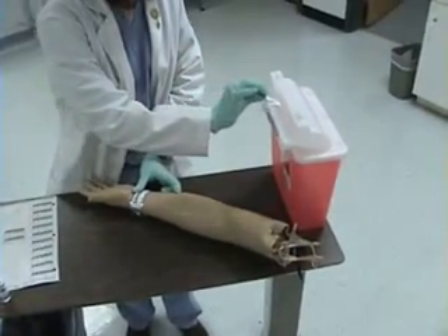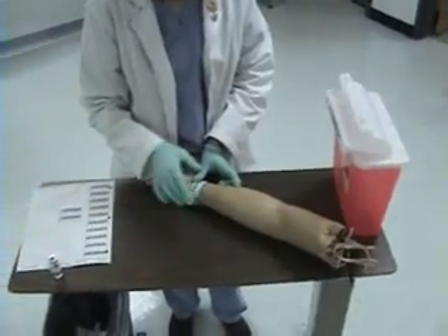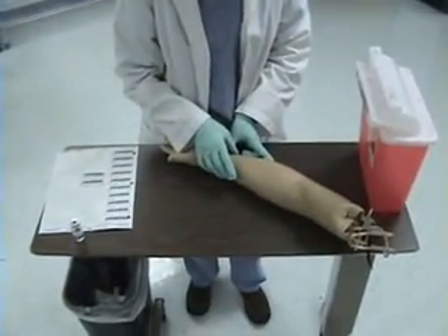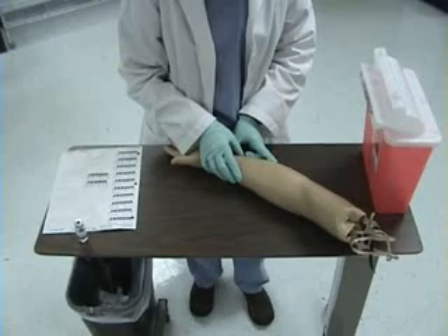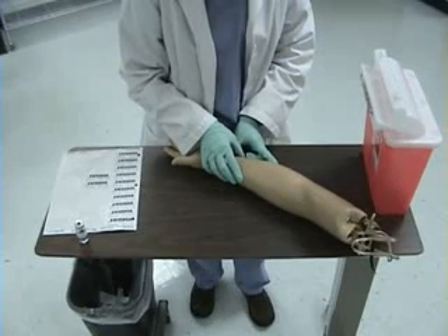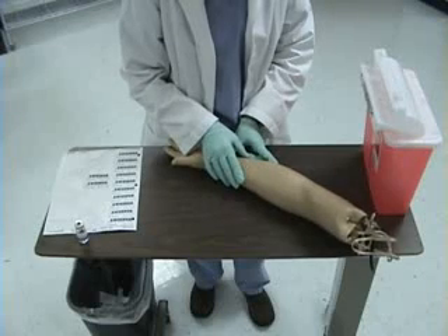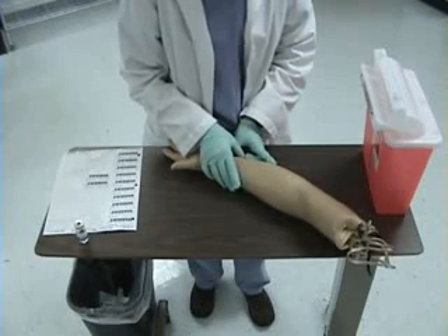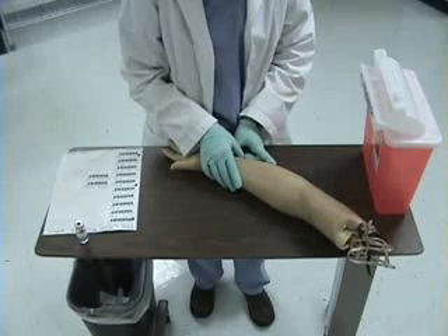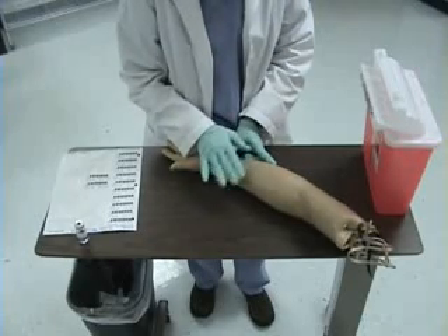I will draw the needle. Using my safety device on a tabletop, I will cover my sharps and immediately place them into my sharps container. I want to instruct my patient that within 48 to 72 hours, they will need to return to their PCP provider's office to have the skin test read. There should be no redness or swelling at the site, and the patient should not scratch, rub, or touch the injection site.